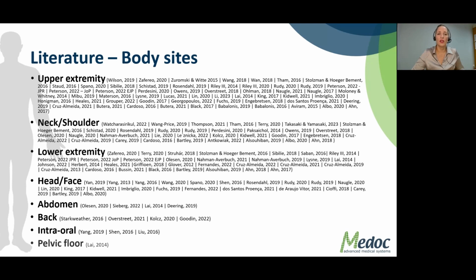And we can see indeed that most common is the upper extremity, but neck, shoulder, and lower extremity are also quite common. There's also quite some work being done on the face, and we see a lot of testing on the masseter muscle for temporomandibular disorder, or on the forehead for migraine patients, but also some intraoral work on the tongue for burning mouth syndrome, or on the teeth for dental applications. So you name it, it has been done. But this is just to give you an idea of what's most common and what has been done in the past.